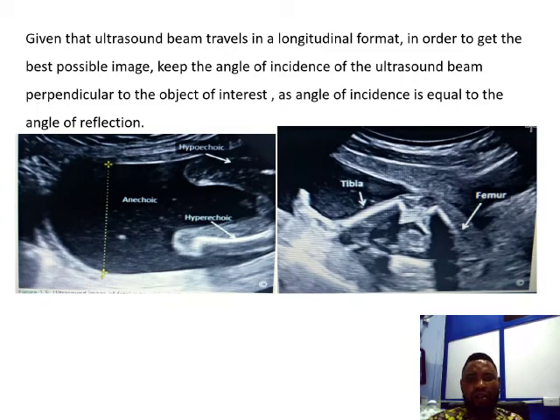Given that the ultrasound beam travels in a longitudinal format, in order to get the best possible image, keep the angle of incidence of the ultrasound beam perpendicular to the object of interest, as the angle of incidence is equal to the angle of reflection.